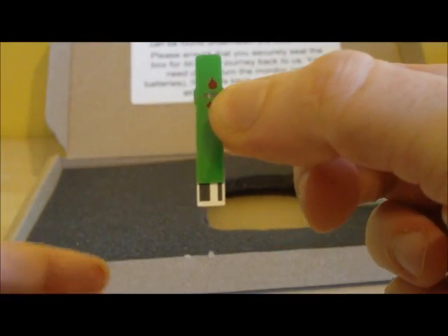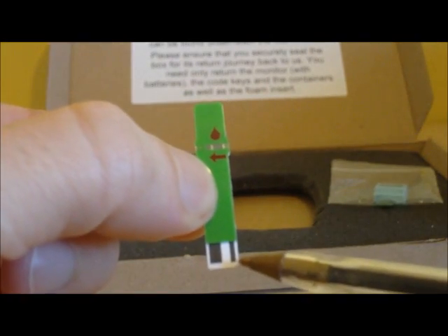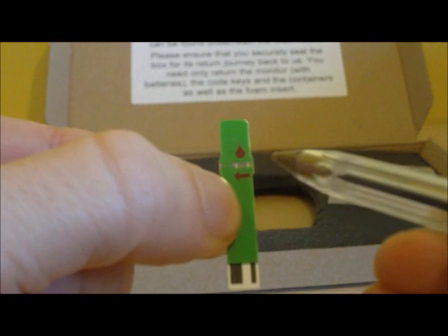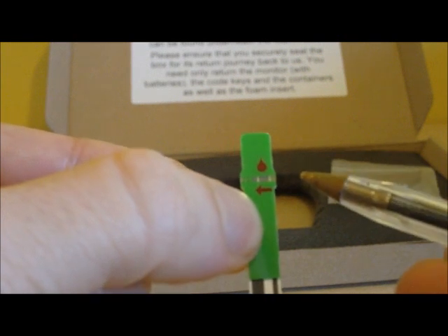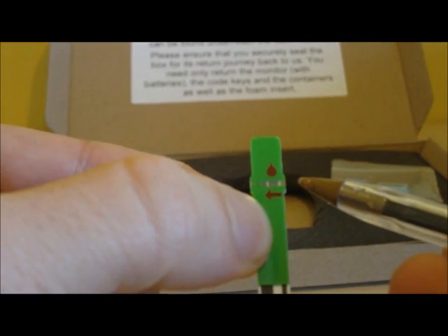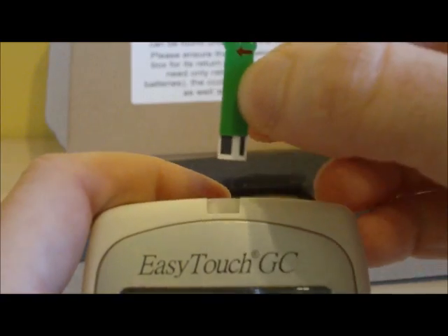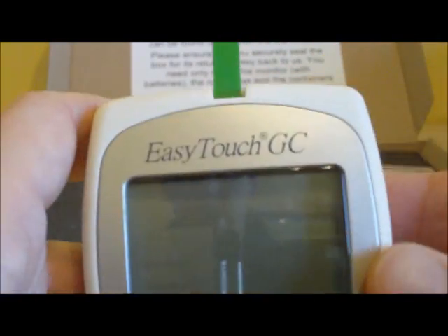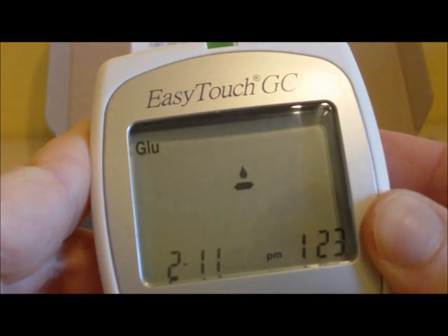Take your glucose test strip. It is very similar to the cholesterol one — it has a barcode region, a test area along the middle, and an arrow indicating which direction to apply the blood sample. Unlike the cholesterol strip where you can go in from either side, on the glucose test strip it is important that you only apply the blood from the side shown by the arrow. Insert the test strip into the top of the monitor and it springs to life, displaying the blood drop symbol.